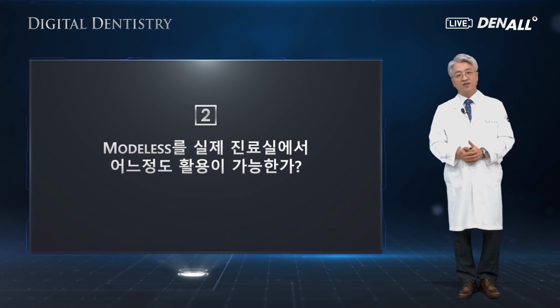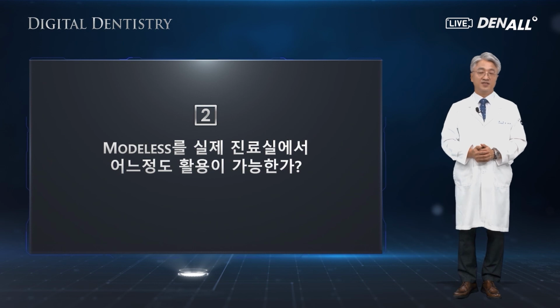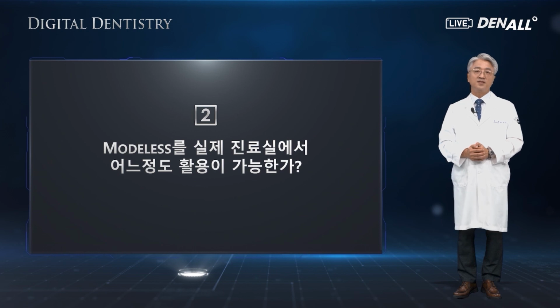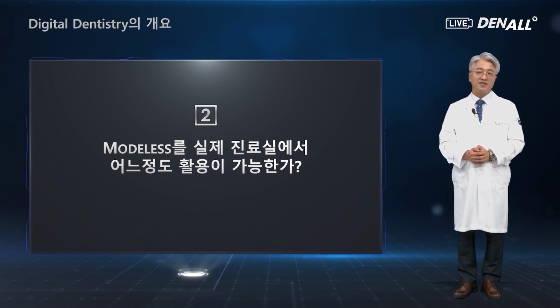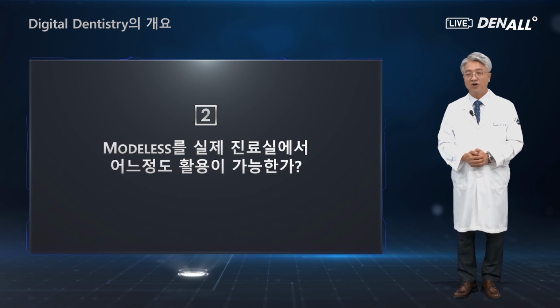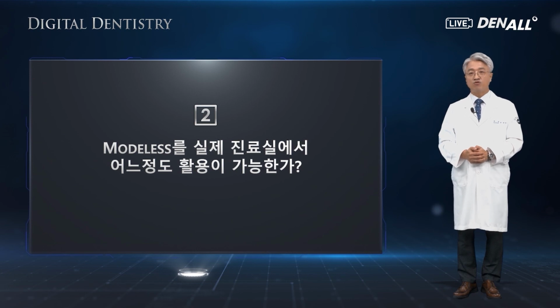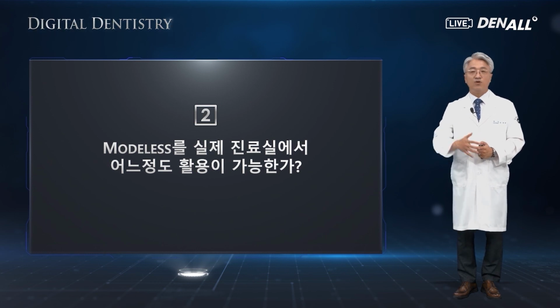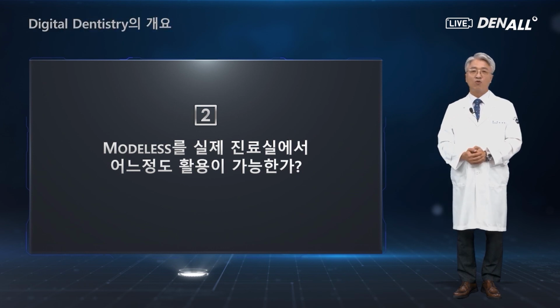Next question, how much model-less approach can be used in a clinic? In our clinic, all impressions, like 98%, is done model-less. Our clinic provides almost all services, including prosthodontics, implants, and orthodontics. For about the last 2 years, we have used the oral scanner for model-less in 50% or more cases. Right now, just except a few cases like RPD, we use model-less in most all of clinical cases.